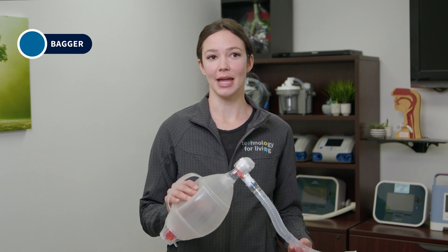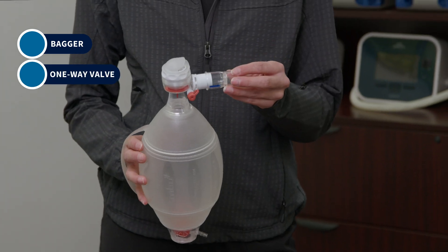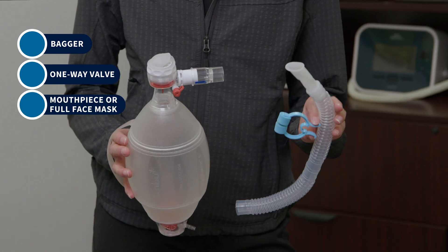This technique helps to take a larger breath by pumping in more air, rather than relying on weakened chest wall muscles to pull in air. The ambu bag is a manual resuscitator commonly used in medical settings. It consists of a self-inflating bag, a one-way valve, and either a mouthpiece with nose clips or a mask.